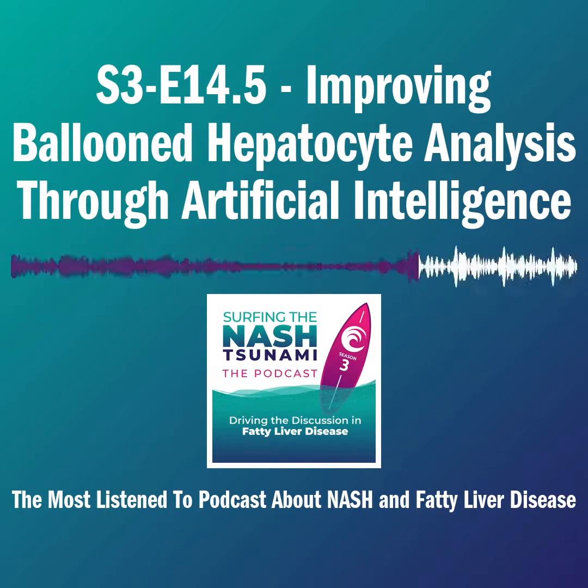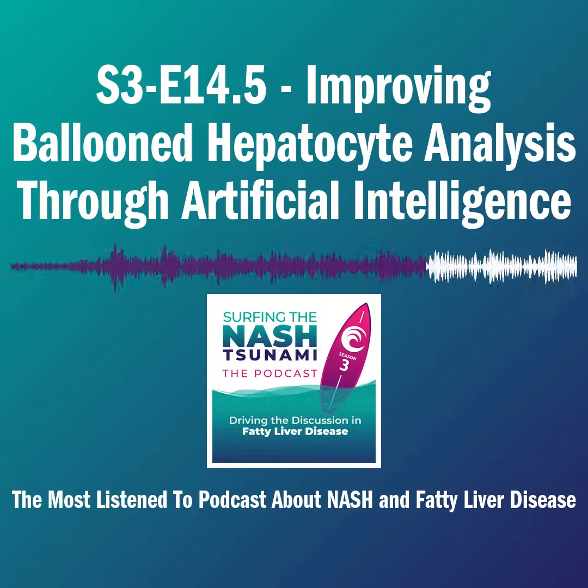Actually, in cirrhotic samples, we realized that there is a huge collapse. You can have one big chunk of portal tract. You can probably spot like 5 portal tracts strung together. There's no more tissue, everything collapsed. So we actually had a problem establishing, is this a big portal tract or is it a septa? So how to properly define what you call septa width? And bear in mind, this is a needle biopsy, so you are also limited by the size of the needle itself. For example, the width is probably as far as we can measure.